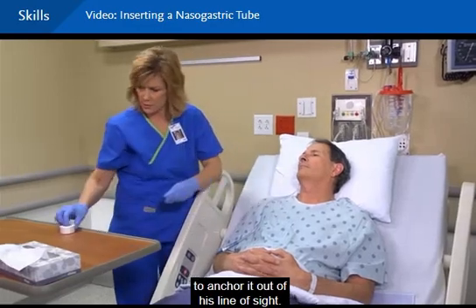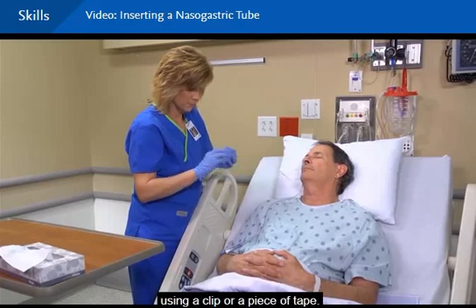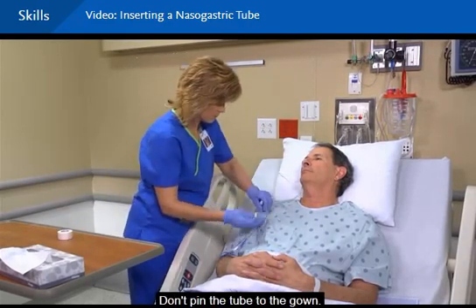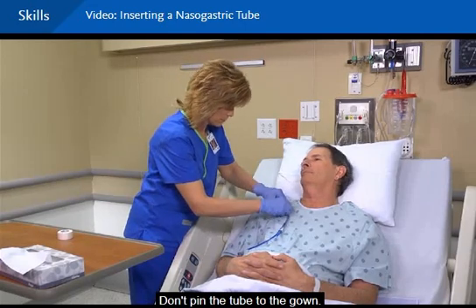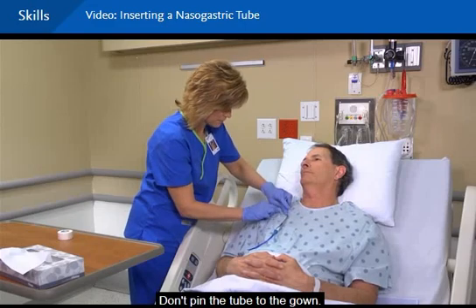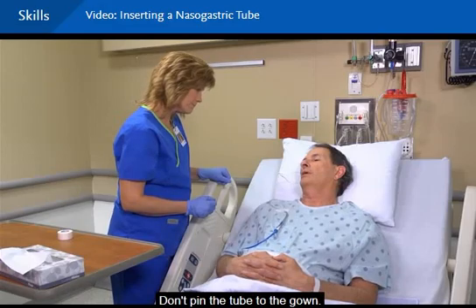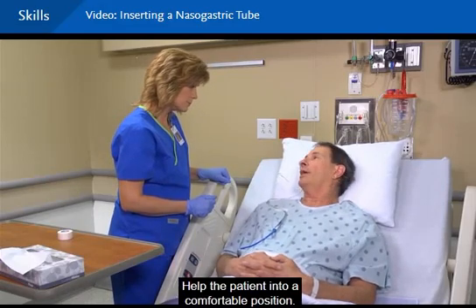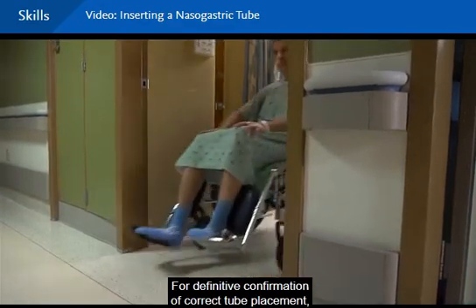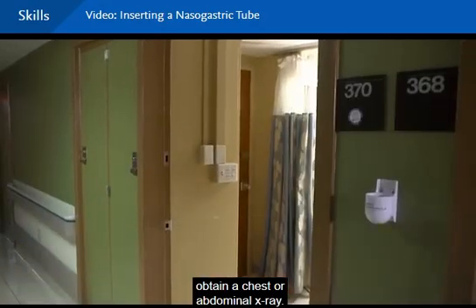All right, now I'm just going to tape it to your gown as well. Okay. Fasten the end to the patient's gown using a clip or a piece of tape. Don't pin the tube to the gown. Just like that. Can I get you more comfortable right now? Help the patient into a comfortable position. For definitive confirmation of correct tube placement, obtain a chest or abdominal X-ray.